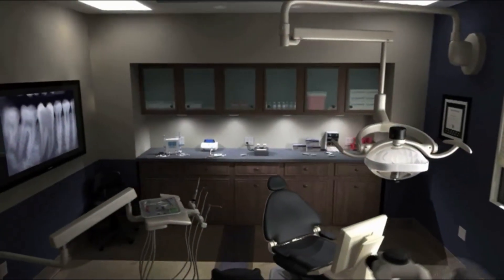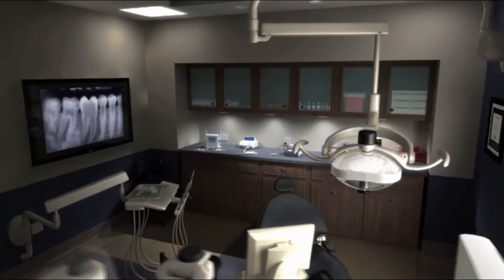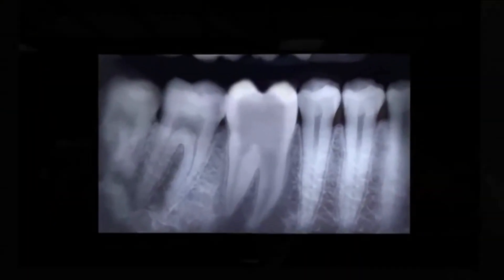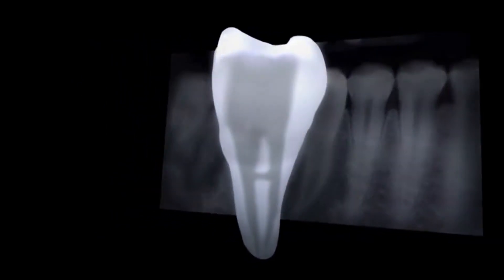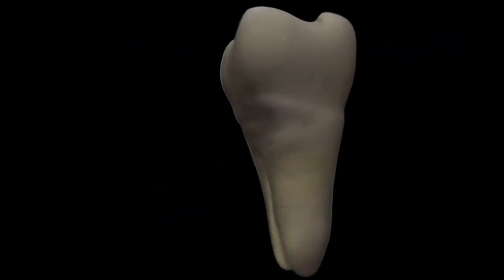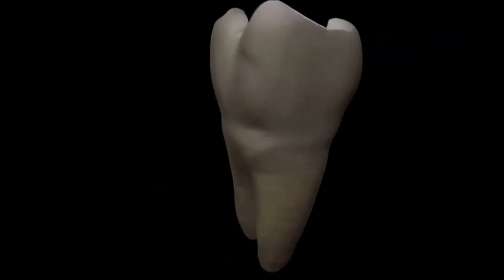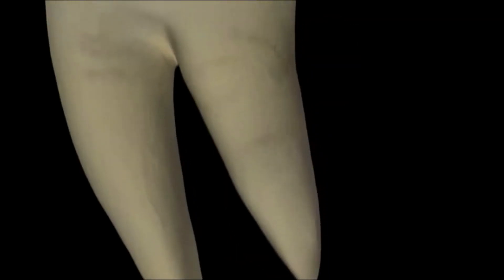Radiographs are valuable, but can only show two dimensions. Let's look at the complex root canal system through the three-dimensional view of a micro CT scan, complete with laterals, isthmuses, and exit points. GuttaCore Obturators help you achieve a dense 3D fill in the most challenging canal systems.